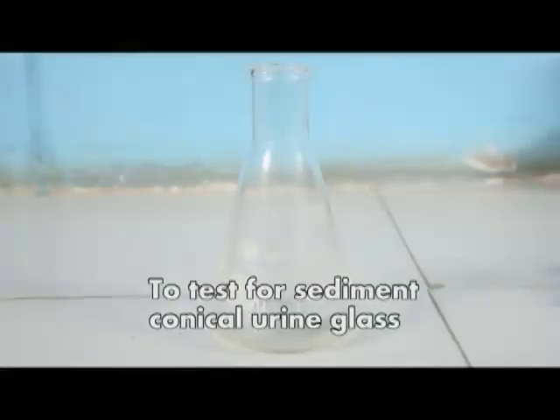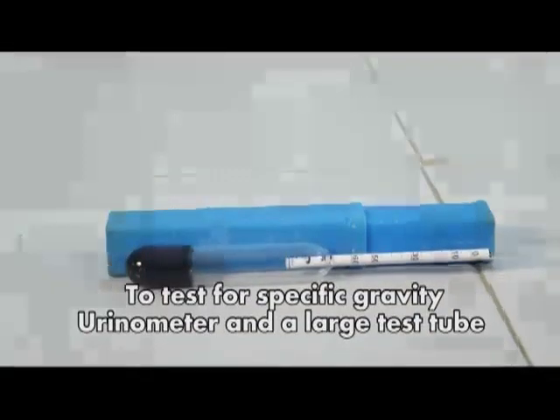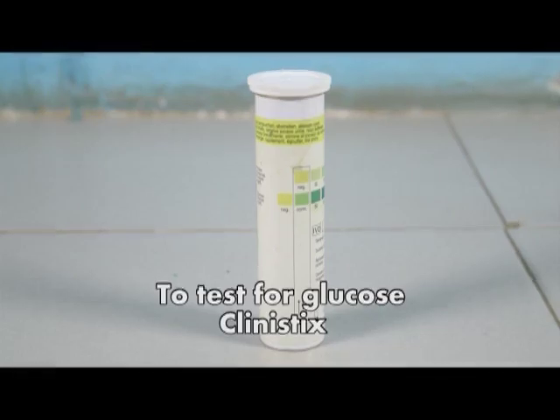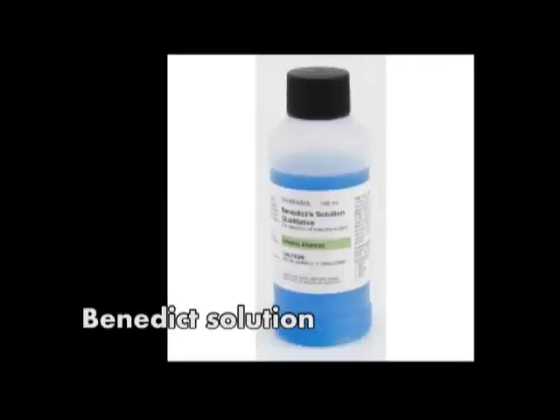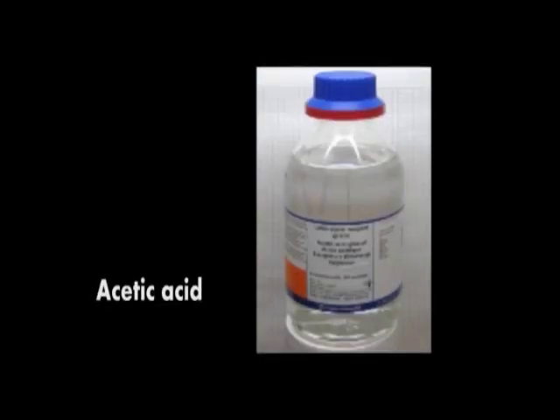To test for sediment, conical urine glass. To test for reaction, red and blue litmus paper. To test for specific gravity, urinometer and a large test tube. To test for glucose, Clinistix, Clinitest tablets, Benedict's solution. To test for albumin, Albustix, acetic acid.